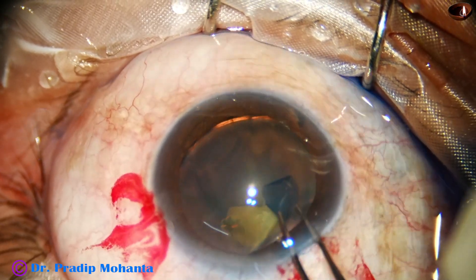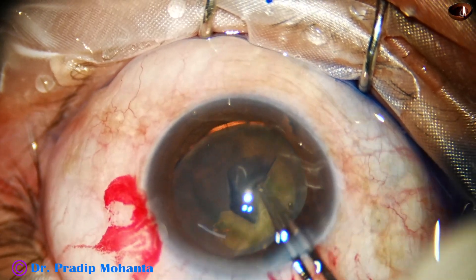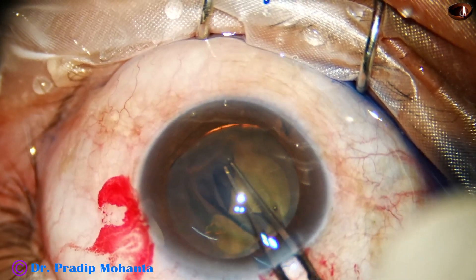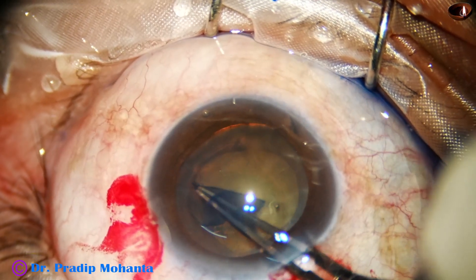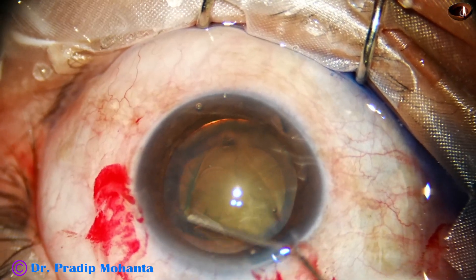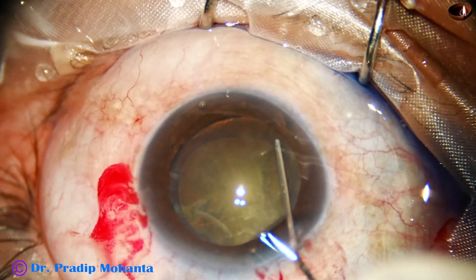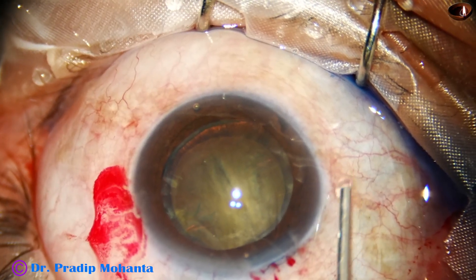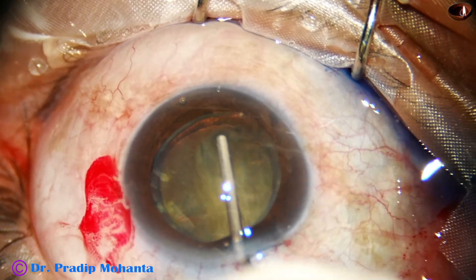The rhexis should be made eccentric. A lot of capsular material should be at the dehiscence area and in the area where the bag is attached. The rhexis is near the pupil margin — very bordered near the margin of the iris superiorly, and away from the margin of the pupil inferiorly. Eccentric rhexis, but ultimately this will be centered once we place the lens.